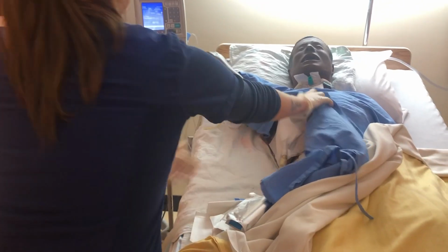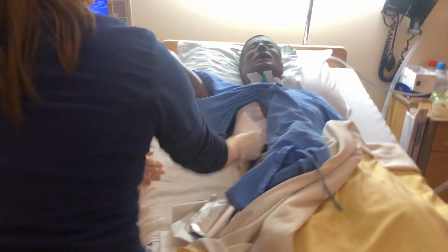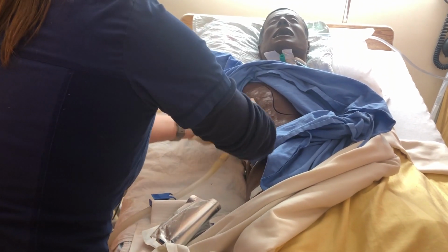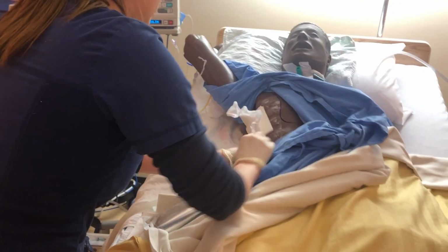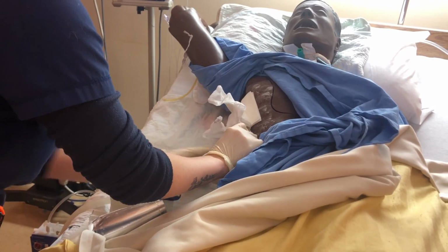So to remove it, I'm making sure not to turn my back to my sterile field. I'm going to pull it down, make sure it comes off. I'm going to also just make sure that I'm stabilizing the chest tube so that it doesn't fall out.